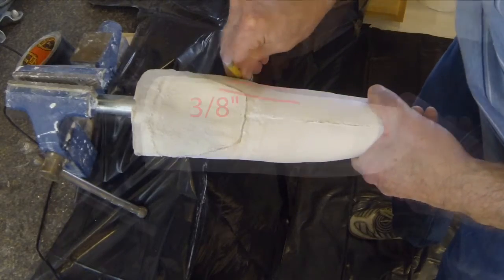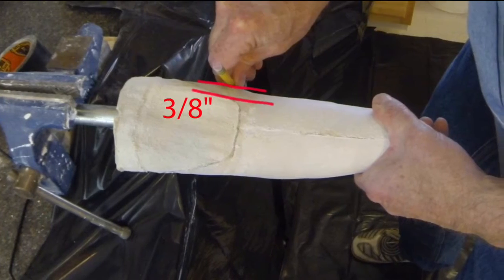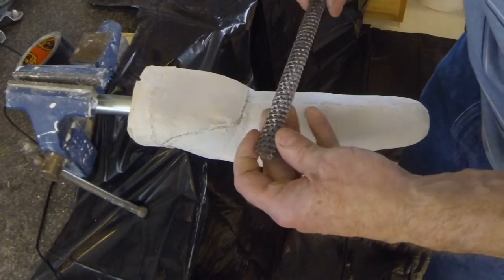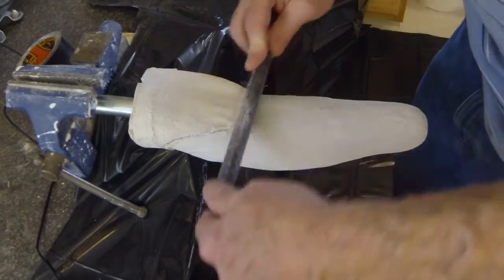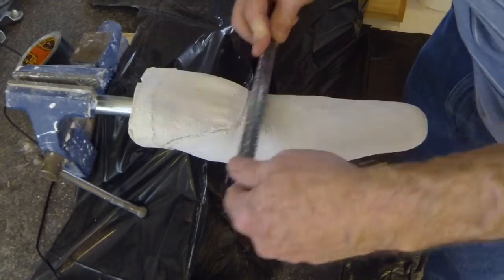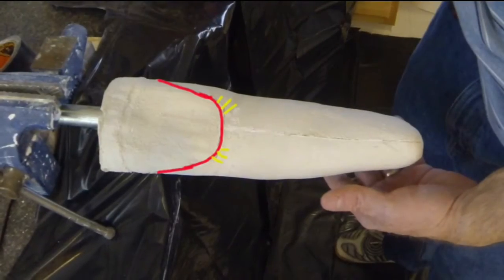The medial and lateral walls of the brim should cup in around the limb about 3/8 inch as shown. Begin to shape the anterior wall to be a U-shape as shown. Avoid leaving square edges that could lead to stress points for the silicone socket where it may tear.